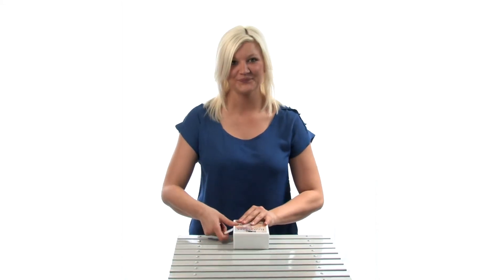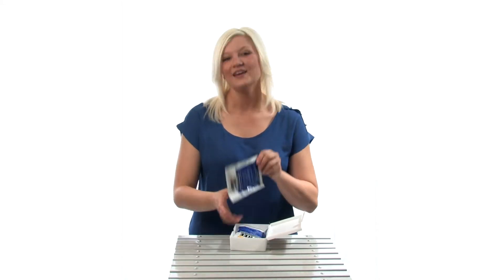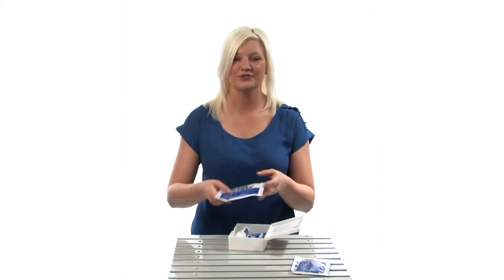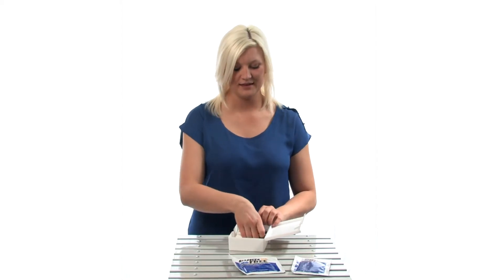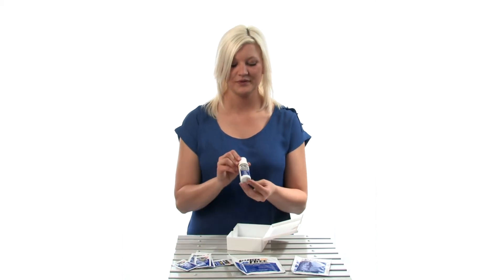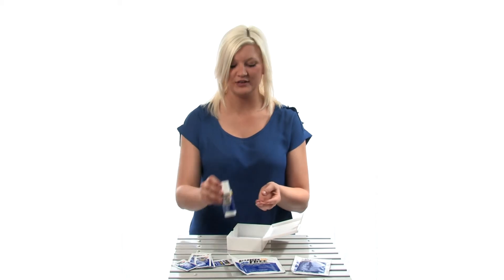One two-inch by six-inch sterile burn and wound dressing, one four-inch by four-inch sterile burn and wound dressing, six single-dose three-and-a-half gram packets, and one two-ounce bottle of pain-relieving gel.